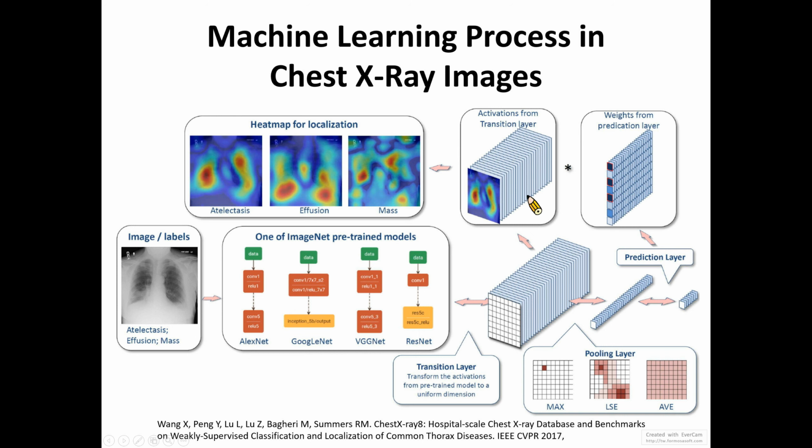If you want to retrain a model by initializing parameters using the same models, it will take a lot of time to finish the training. Maybe you need several days to finish the training. So in this paper, they also achieve high accuracies on the chest X-ray and also the CT images.